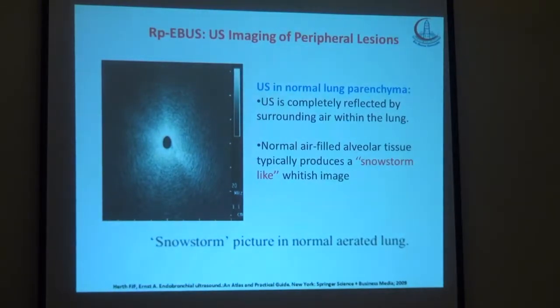طيب ايه اللي احنا بنشوفه في الريديال بروب سونار لما بنخش؟ زي ما الدكتور حسن قال لكم السنو ستورم ابيرنس، ان هي اللانج باريكيما زي السنو ستورم، واول ما بتلاقي ده تعرف ان انت في نورمال لانج تيشو زي السنو ستورم، زي العاصفه الثلجيه.